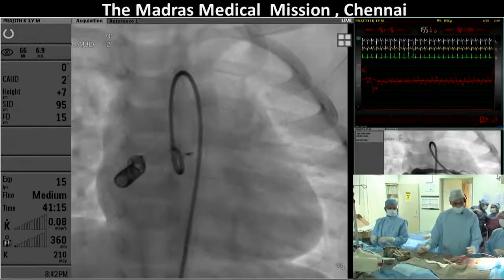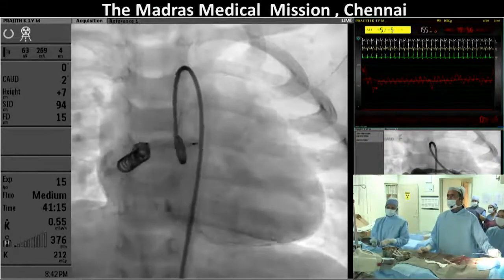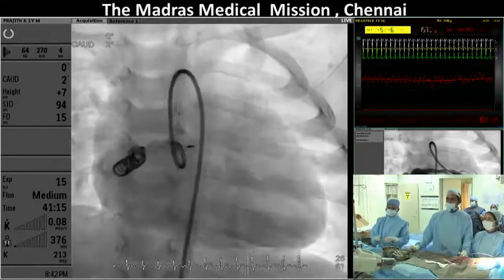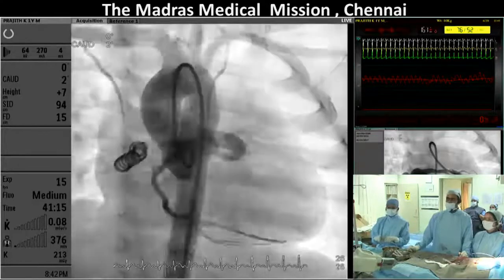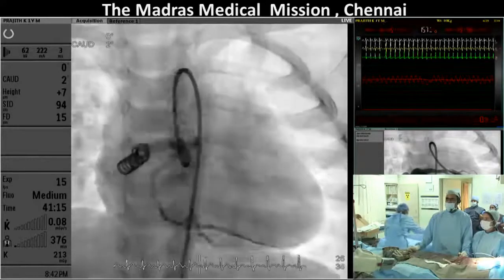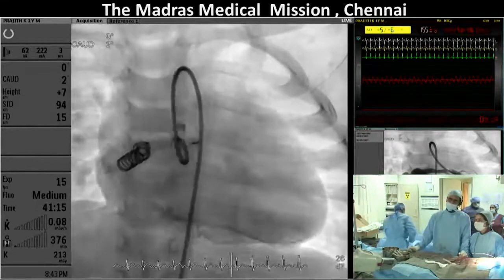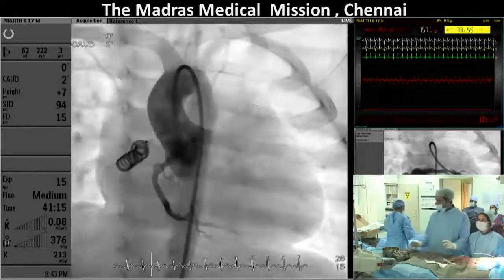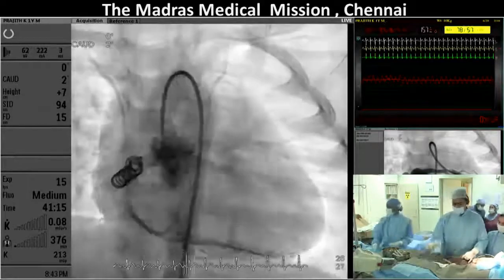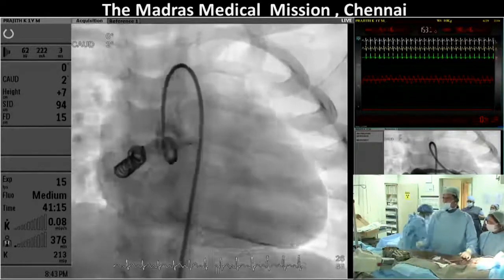I think it's, for the most part, a nice picture. Let's see that. Okay, so the right coronary looks good. The only thing on the table is whether or not that branch that came off very close to the most proximal mark of the device is open or closed, and you may or may not be able to tell with a selective picture. Get me a 5 French EBU catheter. But I think this is a good result. Once again, clean living pays off.